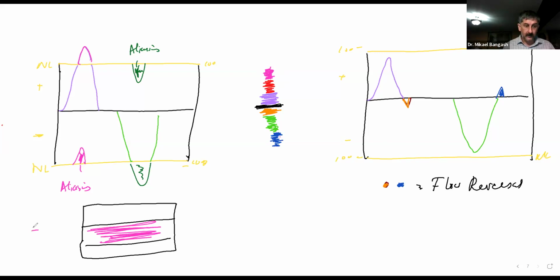As we had that positive Doppler shift, that meant the maximum. In this case we could say that your aliasing would be displayed by this color here. Did you guys get that?